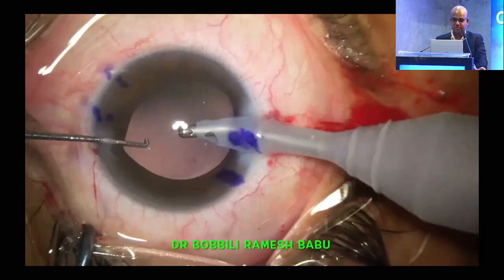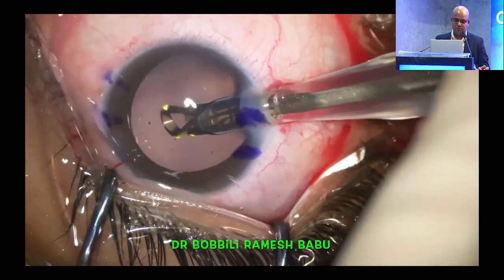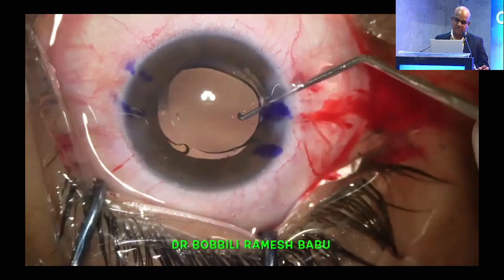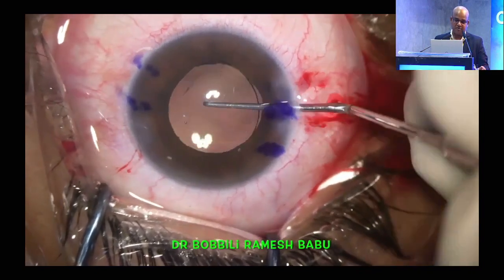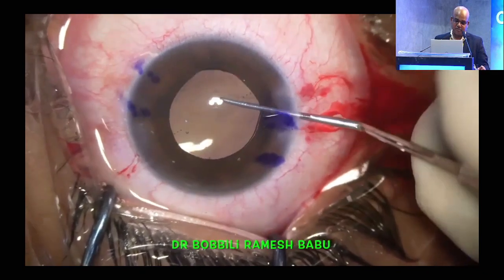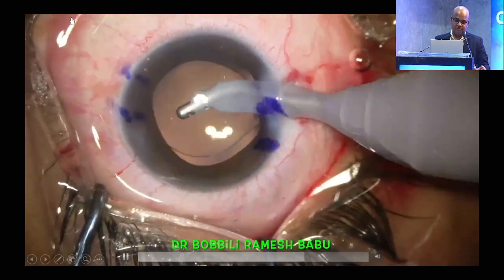Then the IQ toric IOL will now be implanted. This one is implanted into the bag. Now the viscoelastic removal: we remove it just 2 clock hours short of the required placement, then place the lens. This is the horizontal axis, and this one is the intended axis.